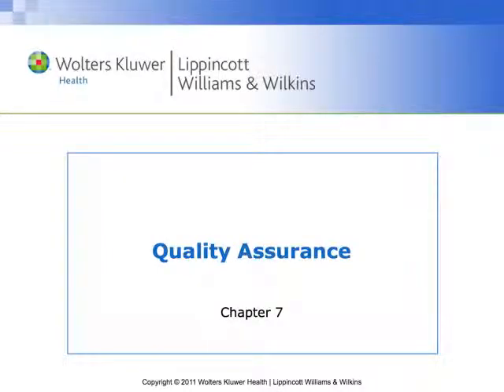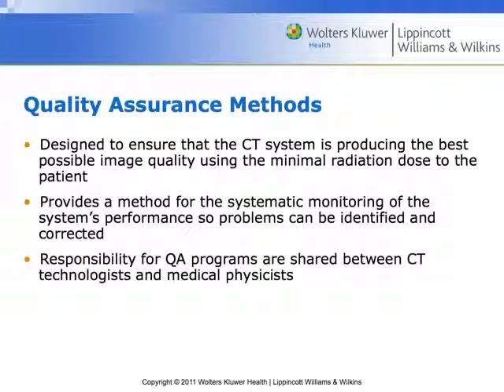Okay, quality assurance. Quality assurance is designed to ensure that a CT system is producing the best possible images using the minimum amount of radiation, right? And it provides a method for systematically monitoring the system's performance. We're going to do QA every week or every day, depending on what our criteria is.